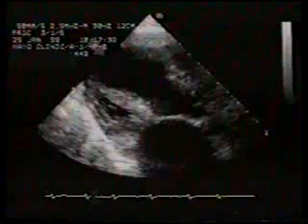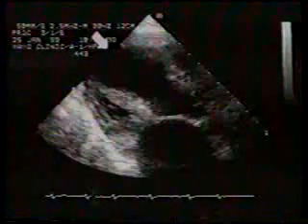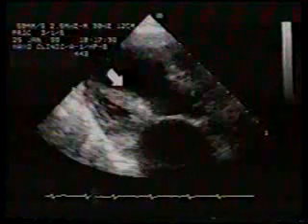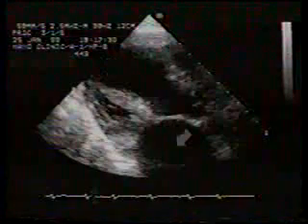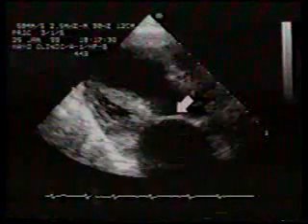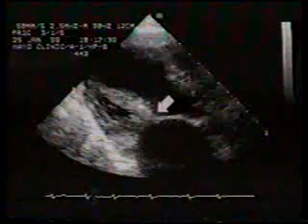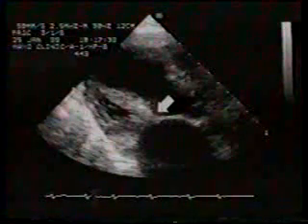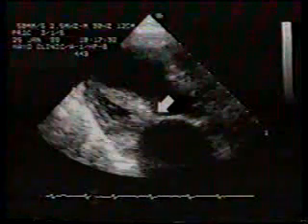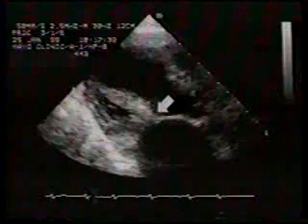However, this is the same patient imaged with the transducer positioned near the apex and tilted to inspect the subvalvular apparatus. This is the left atrium, and this is the anterior mitral leaflet. Note the marked chordal shortening and thickening. In cases such as this, the true minimum orifice is subvalvular and cannot be identified for planimetry.